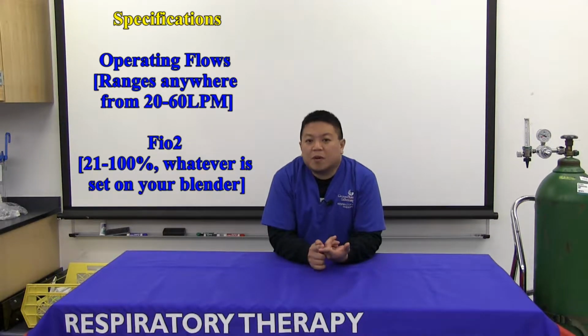So you can go anywhere from 20 liters per minute, 30, 40, 50, 60. As far as FiO2 is concerned, there's no range on this either. It's anywhere from 21% all the way to 100%. Just depends what you have set on your oxygen blender, which I'll show you in a minute to set up this device. So let me go grab all the stuff and put it all on the table for you, and I'll explain one by one.